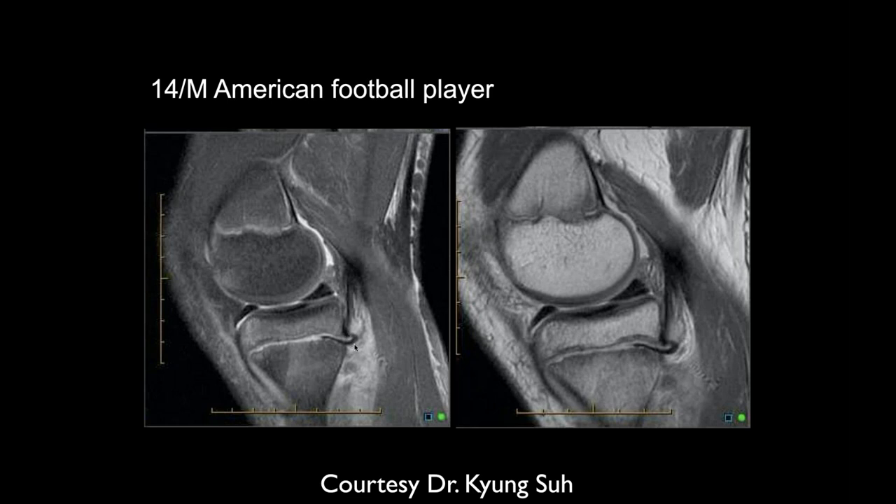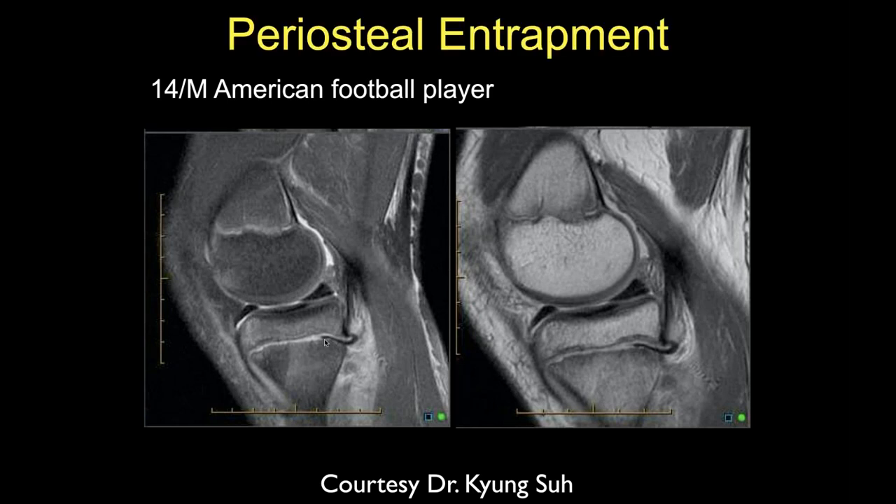Here's an adolescent American football player who had a knee injury. He still has growth plates, and we can see a Salter-Harris fracture through the growth plate where the periosteum ripped and flipped into the fracture site. There's debate about periosteal entrapment — one group feels they should be surgically removed for normal growth, but most surgeons here leave them alone, finding that re-damaging the growth plate is more likely to produce growth abnormalities than leaving the periosteum in place.